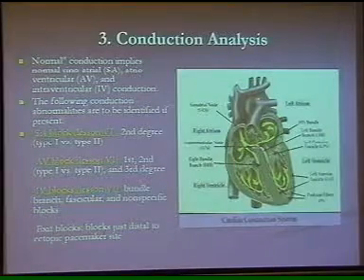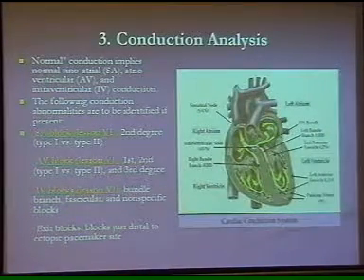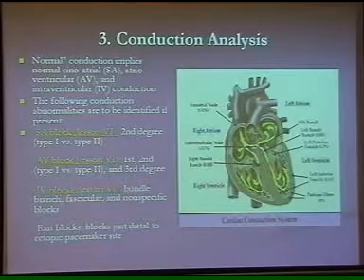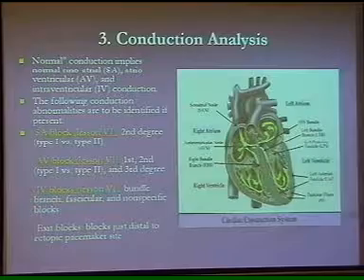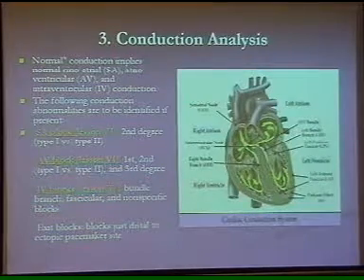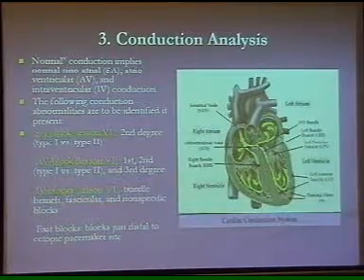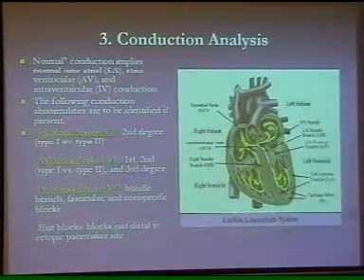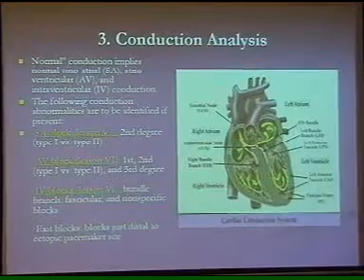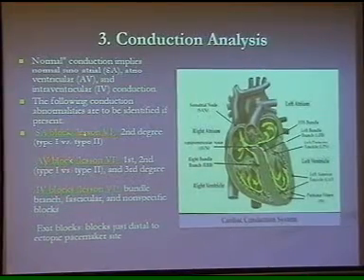And then the cycle restarts. The third degree heart block is complete AV dissociation. There's no relationship of P and QRS complex. Therefore the ventricles are either having a junctional rhythm or idioventricular rhythm and not a sinus rhythm. So that is the abnormality of the AV node.